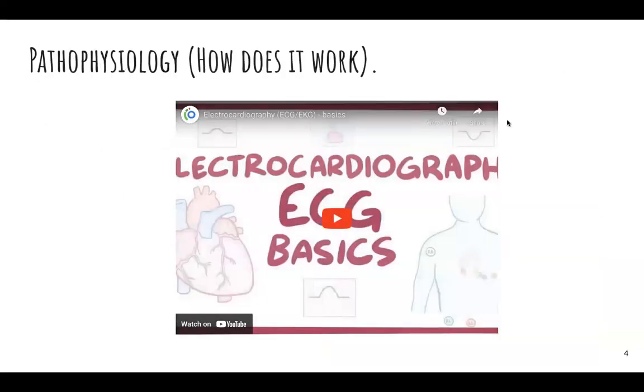So here is a little video on the pathophysiology about it. Like I said, this could go into a lot more depth. I could do an entire lecture just on the pathophysiology alone. That being said, I'm just wanting you to be able to visualize what the EKG is doing, what the EKG is looking at. And this will give you a good visual, hopefully to have you put two and two together to be able to make the connection of essentially why are you doing this. So let's go ahead and start the video.